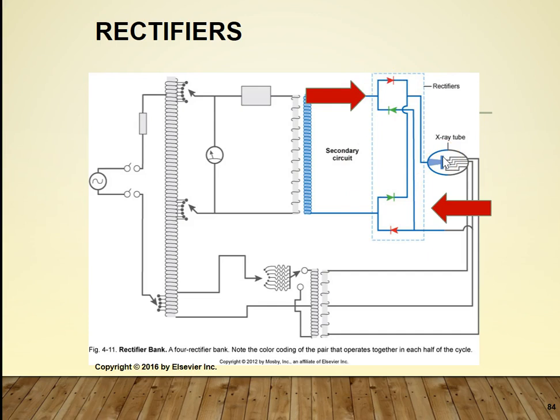Through this, it's necessary to route it through the tube correctly because the tube, except for the filaments, is part of the secondary circuit. And because the tube head assembly is the subject, and we've already covered that in Chapter 5, it is addressed in detail here. So here's just our secondary circuit. There's our second part of the step up, and then these are the rectifiers here, and they are needed to change the alternating current to direct current.